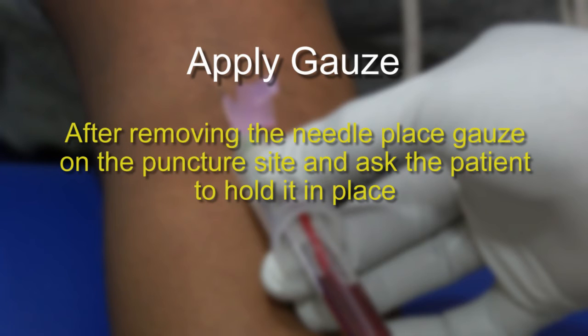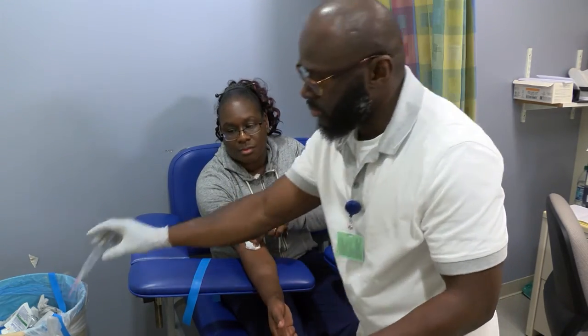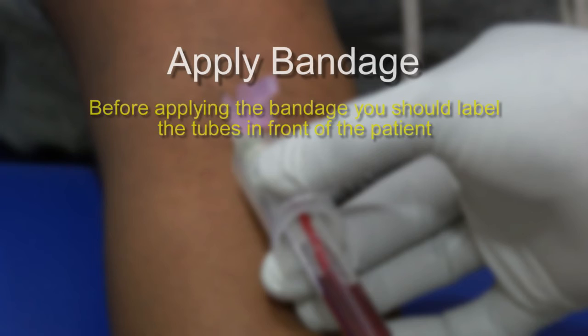Apply gauze. Upon removing the needle, place gauze on the puncture site and ask the patient to hold the gauze in place. During this time, you should also discard the needle. Prior to placing the bandage, you should also label the tubes. This allows the patient to see you have placed their name on the tube prior to discharging them.